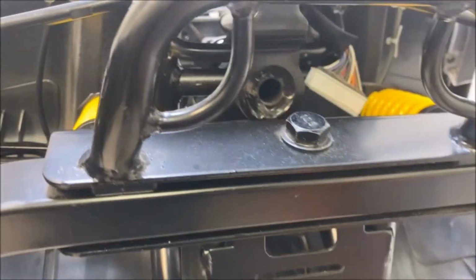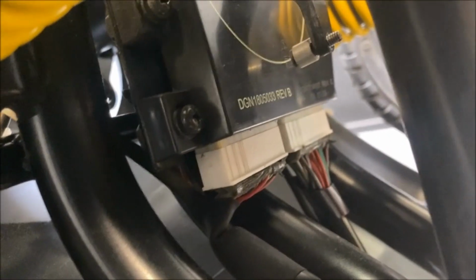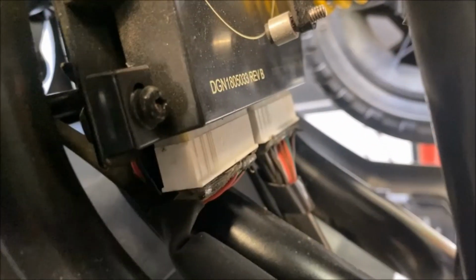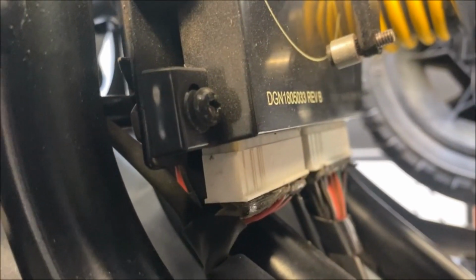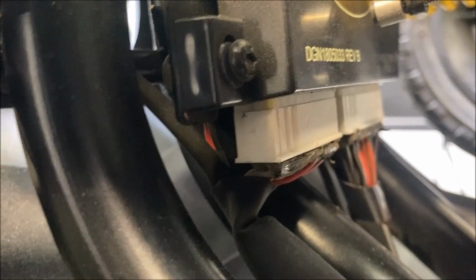Okay, if you're going to do any cleaning or servicing on one of these, these are the portions you've got to be careful with. Under here you have this circuit board with the detector on it. That detects when it's turning. If you can see that little thing there, that's like a magnet and a metal post. So as you turn, as you can see the line there, it detects which way you're turning. That moves left and right, and that tells which motor to turn.